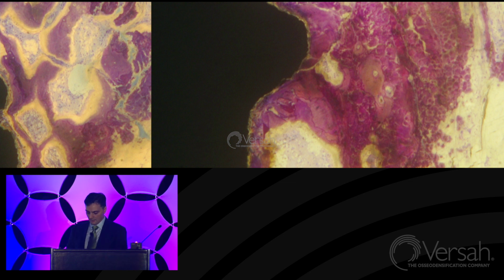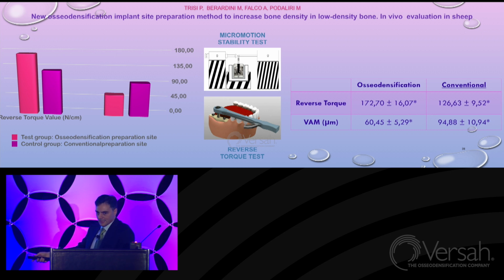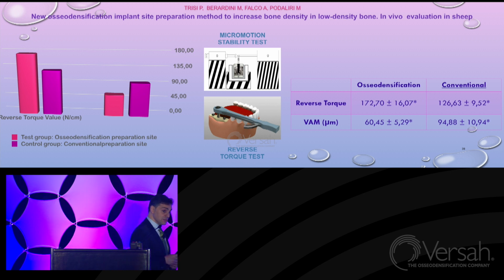So somehow this drilling system is changing the biology. That's why we are facing a different healing process. This is the mechanics of the healing: reverse torque and lateral displacement, which is the value of actual micromotion, how much the implant is moving laterally. And if you compare densification to the conventional one, there is an improvement of at least 30 to 40%, from 120 to 170, from 60 to 94, which is a lot.